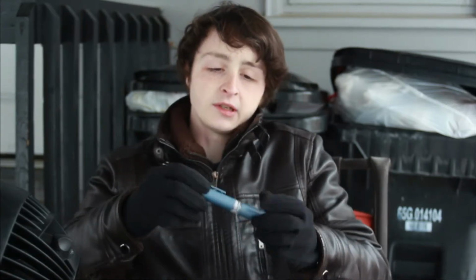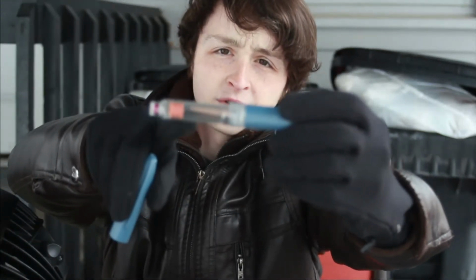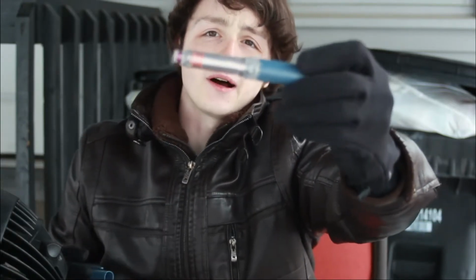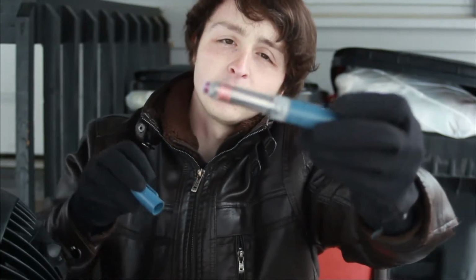Okay? So it starts with actually taking off the cap and cutting off where the syringe is going to go. So we need to cut a line through here and get the vial out. And once we do that, then we can seriously modify it and make it exactly the right proportions and cut in the right spots to where we can fit a syringe in here appropriately. So I'm going to show you that.